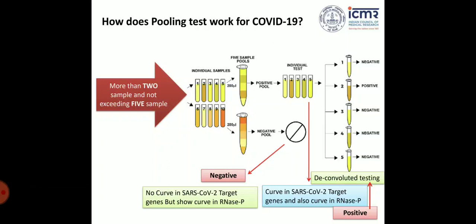That is why ICMR came out with some guidelines on how it should be tested. The reason we use RNase P is to cross-check whether the RNA extraction worked properly. When we pool samples, it is possible that the RNase P from some other patient shows positive, but the patient who is truly virus-positive may have had their RNA not extracted properly or may have inhibitors. You cannot clearly discriminate this — that is the problem.